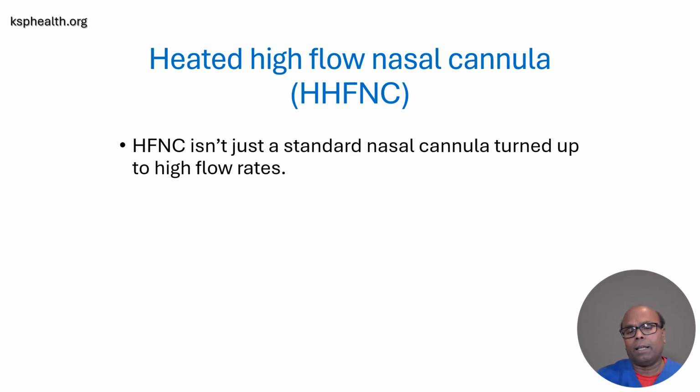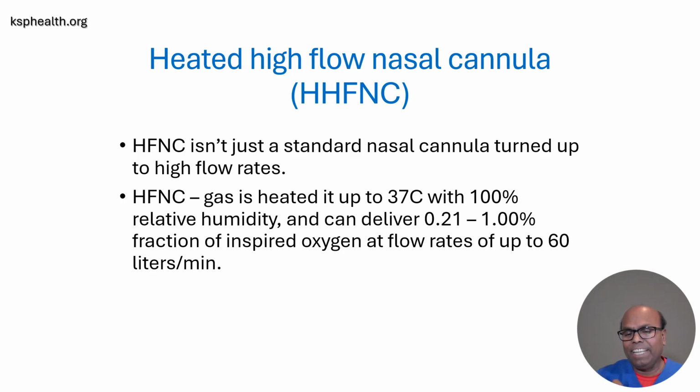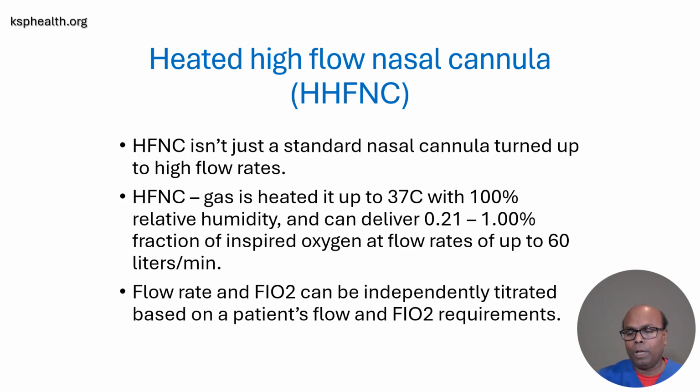The high flow nasal cannula is not just a standard nasal cannula turned up to high flow rates. It is heated up to 37 degrees centigrade with 100% relative humidity. It can deliver room air all the way to 100% FiO2, and the flow rates can go up all the way to 60 liters per minute. The flow rate and the FiO2 can be independently titrated to meet the patient's flow and FiO2 requirements.